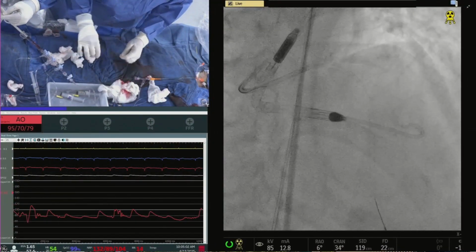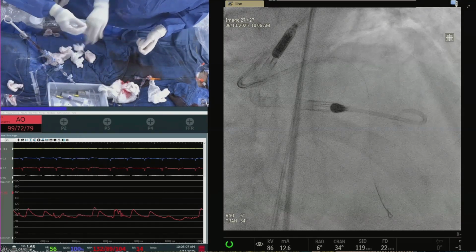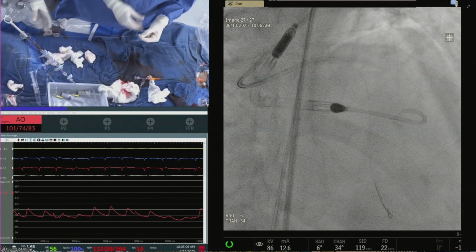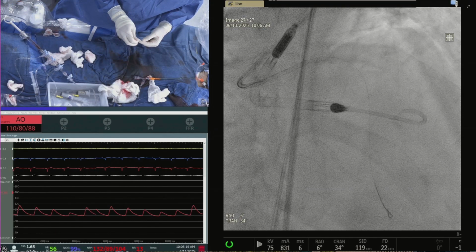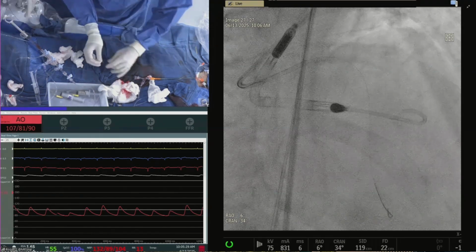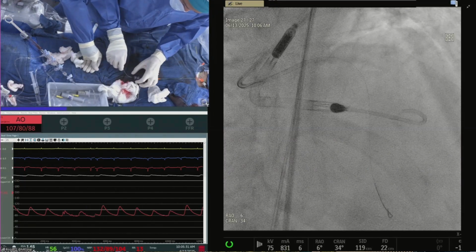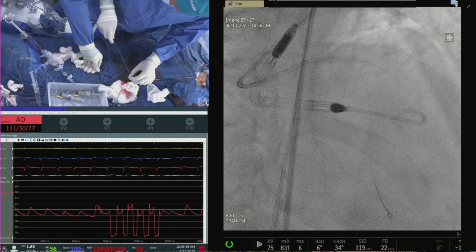So Dr. Kapadia, do you prefer IVUS or OCT in this situation, or you don't care? Of course, OCT is the best because of two things: the thickness of the calcium, and to really understand, have we done enough debulking? The issue with OCT is you may need multiple runs with dye. I know people are doing it without dye, but without dye you don't see it well. So if left main is not involved, IVUS is probably the best.